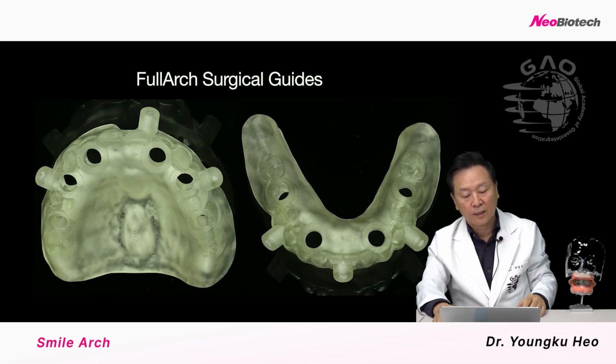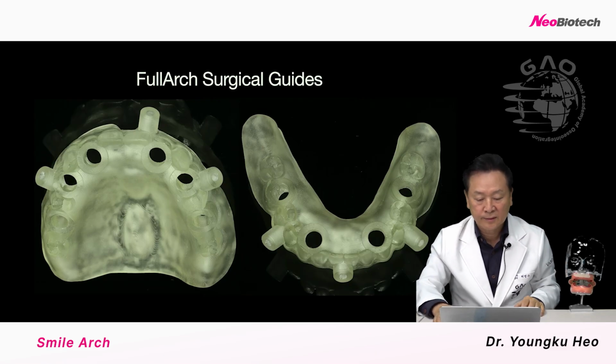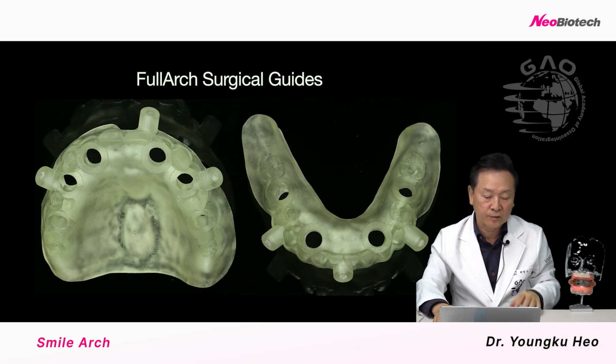Okay, although we made a surgical guide, sometimes we throw it away. We don't use this surgical guide.